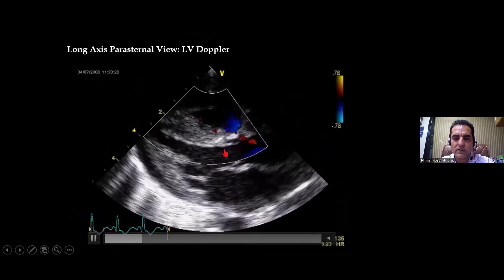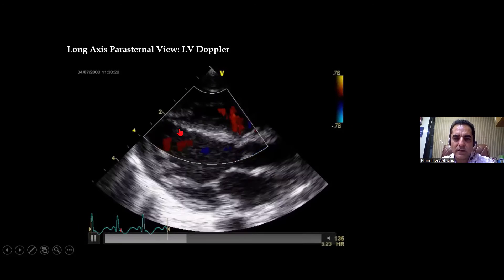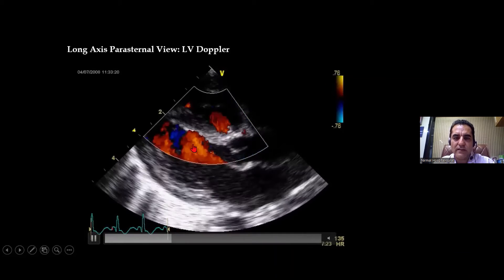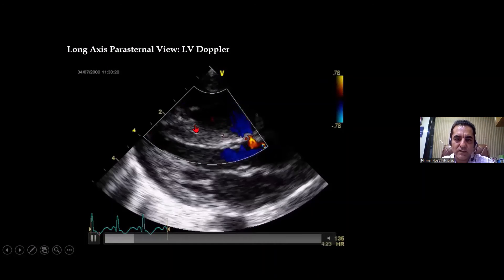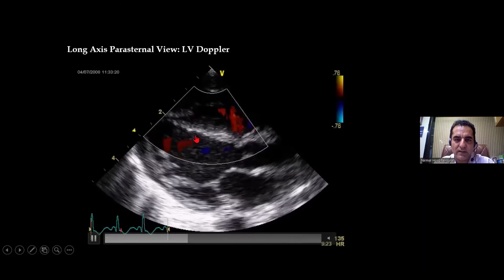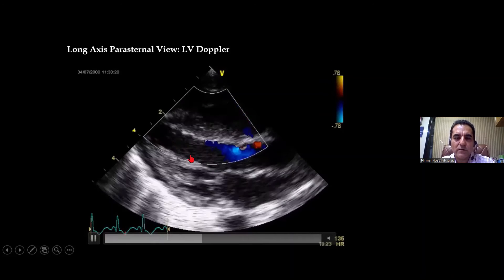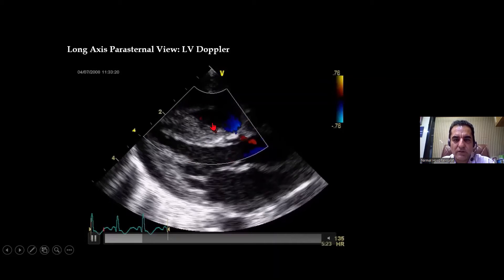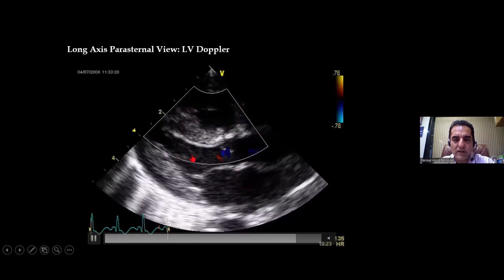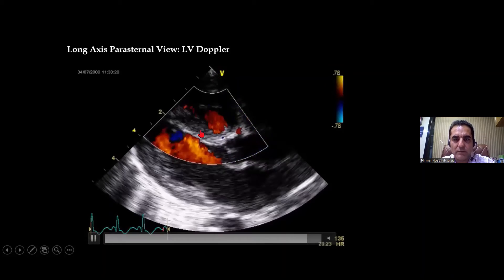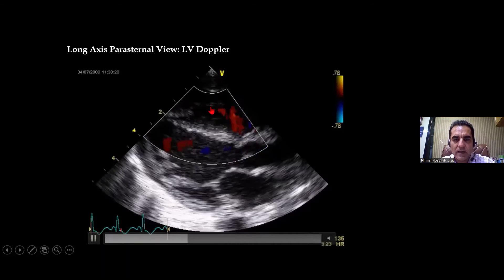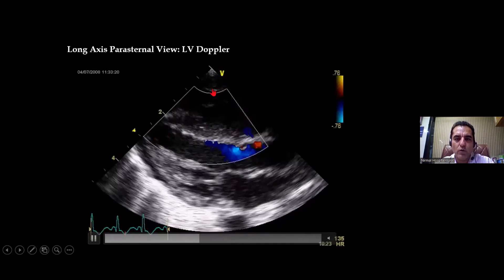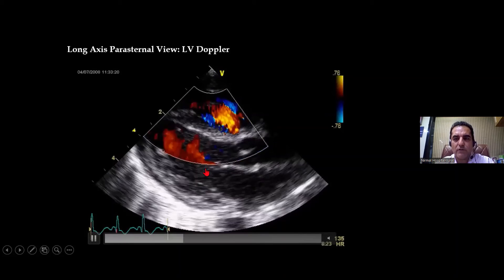We are doing the Dopplers of the interventricular septum to look for any VSD. If there is a VSD, there will be a defect in the interventricular septum and there will be blood flow. If blood is flowing from LV to RV — towards the probe — it will be red. If the blood is flowing from RV to LV, it will be blue because it is moving away from the probe.